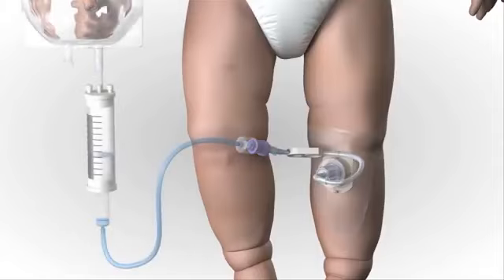Connect fluids if ordered. Infusion may need to be pressurized to achieve desired rate. Assess frequently for any signs of infiltration, extravasation, or other complications. Compartment syndrome is a serious complication that can result from unrecognized infiltration or extravasation.